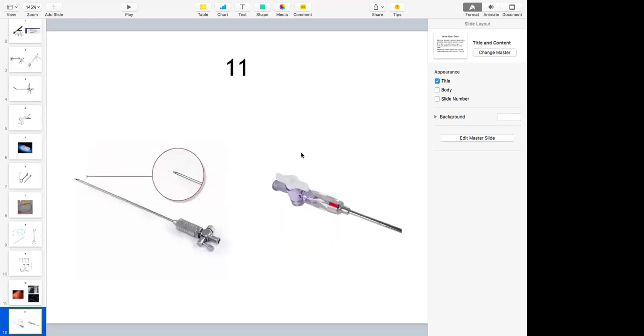Now, same instrument, older variety and newer variety. Identify this instrument. Veress needle, sir. Veress needle. So how do you make sure that Veress needle is inside the peritoneum? This is one patent question. Few points are there. First we do aspiration, sir. No. Aspiration is later. First, while you are putting in, how do you make sure that you are inside when you are putting in?